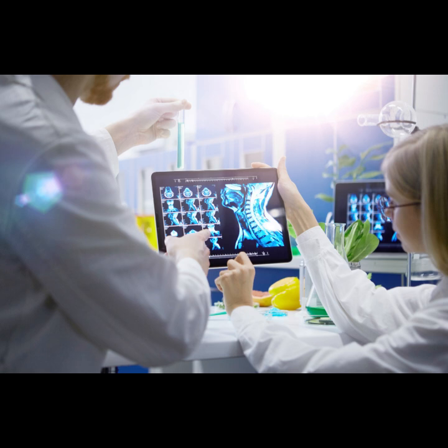And the alternative, single shot, like echo planar imaging, EPI. EPI is the classic example. After a single RF excitation, you use rapidly switching gradients to just zip back and forth, covering the entire k-space grid, or a large chunk of it, in one go within tens of milliseconds. Wow. So incredibly fast. Essential for things like fMRI, watching brain activity in real time, or imaging things that move a lot. Absolutely. Speed is its superpower. But it often comes with trade-offs in image quality or artifact sensitivity.